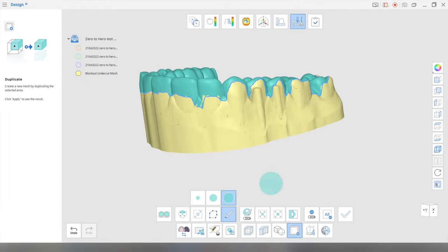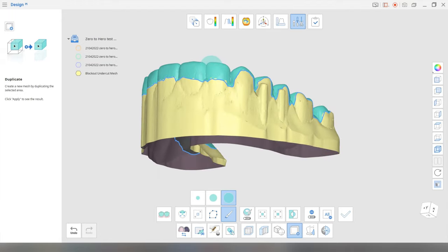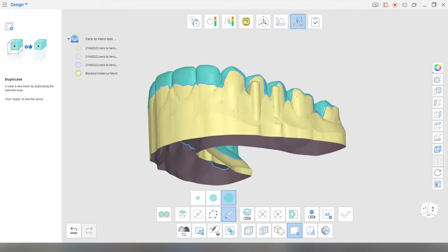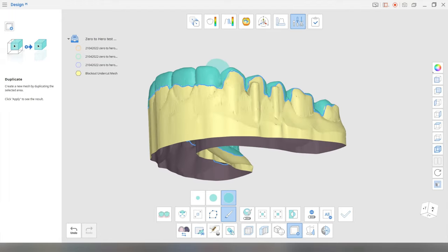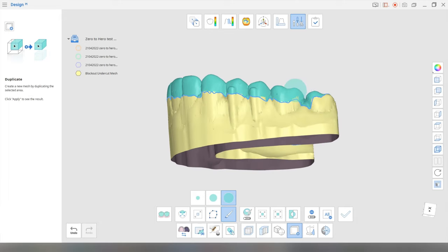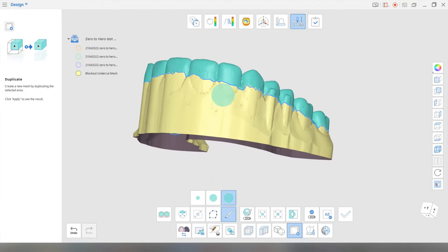As I said, this does take a bit of time. It's not the most seamless software to use, but you definitely want to spend more time on this step because it's probably the most important step. Basically designating what you want included in your splint.